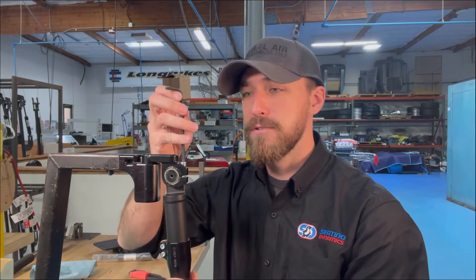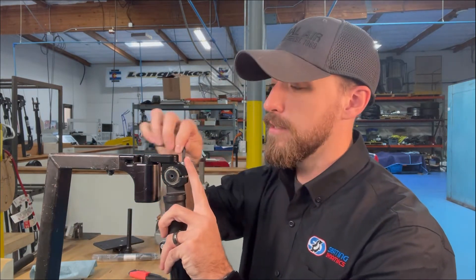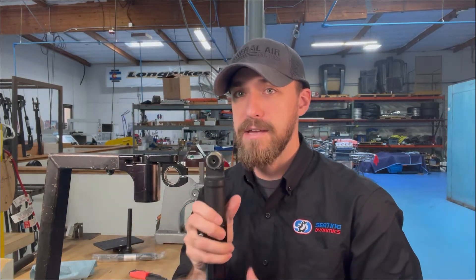Then you're going to grab your five millimeter allen key and loosen up this screw at the top — you don't have to remove it, just a little bit — and that should allow you to push the angle out.